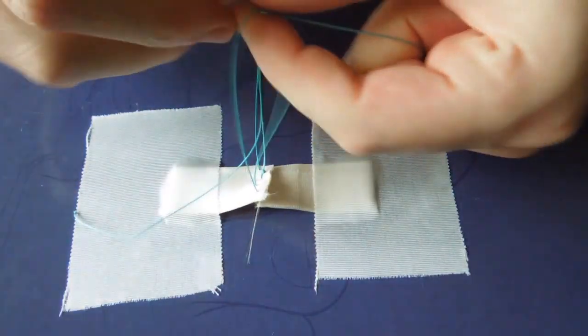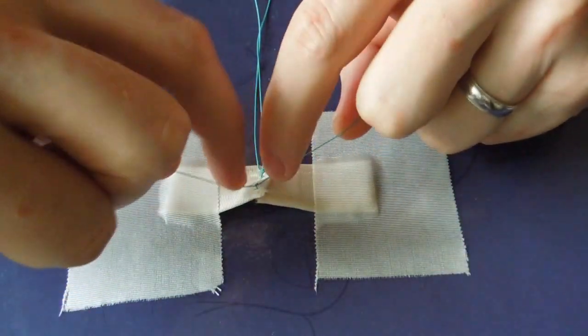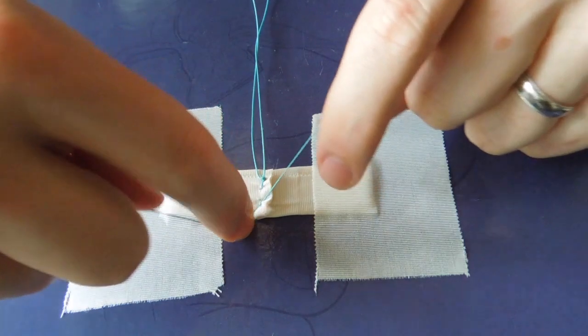The suture we're using here is 0-Ethibond on a controlled release or on a pop-off so that we can remove our needle and perform our hand ties.